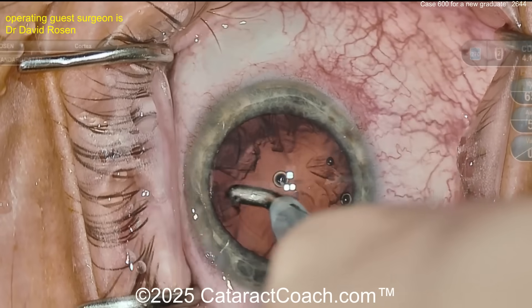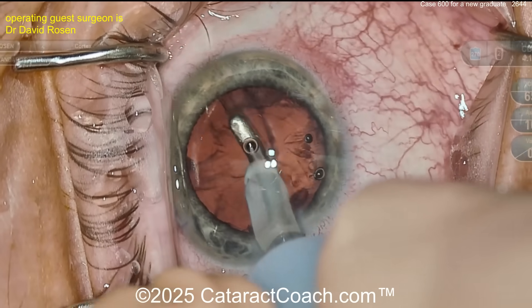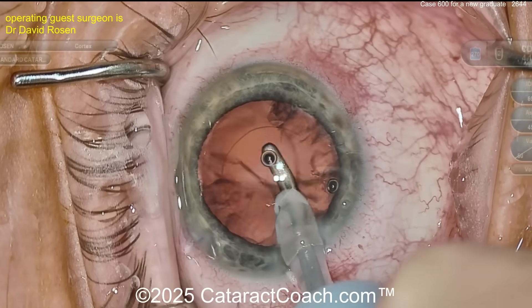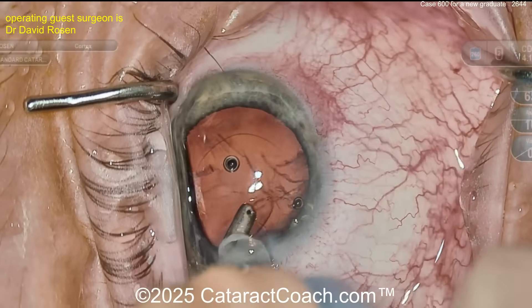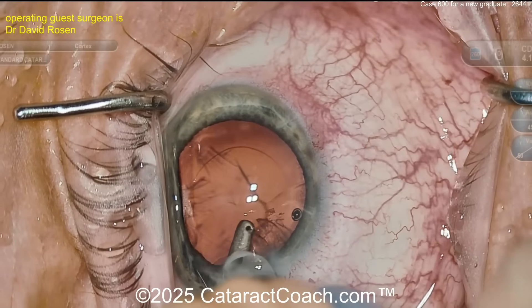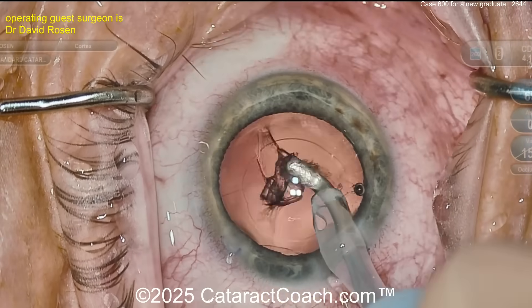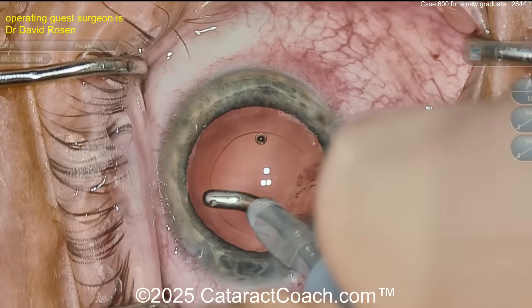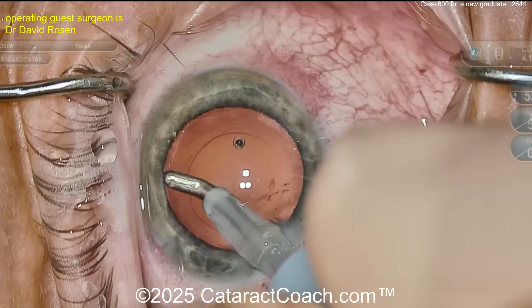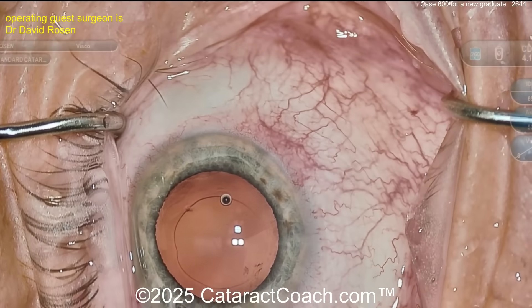That looks pretty good — cleaning it up nicely. I encourage you to learn all the nuclear techniques: flip and chop, tilt and chop, horizontal chop, vertical chop, stop and chop — make sure you know all of them. Now cleaning up the capsule bag, really nicely — that looks great. I like the case so far: I like the draping, the incisions are beautiful, and look at that — polishing the anterior capsule rim too. That rhexis is beautiful, five millimeters measured out, looks great.